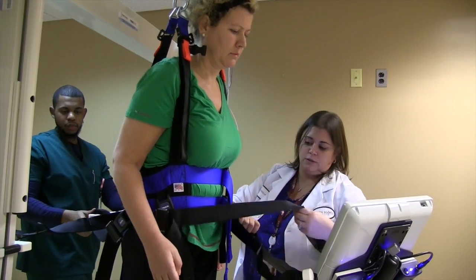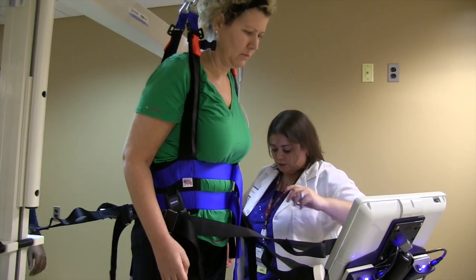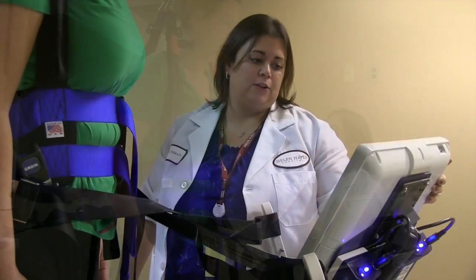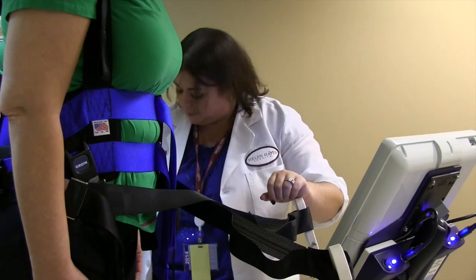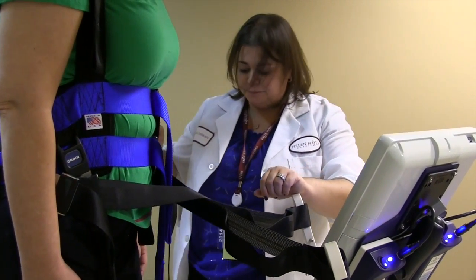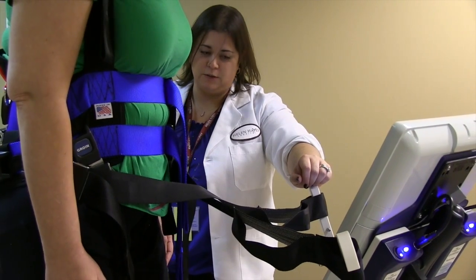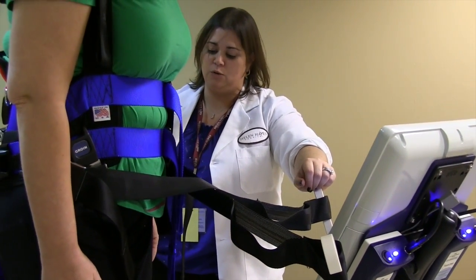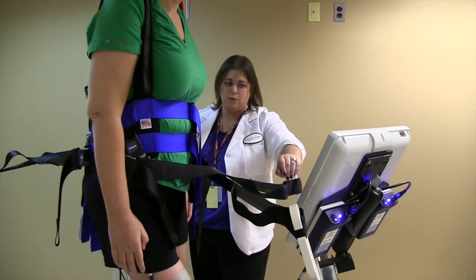You don't want the guides too tight where they hold the patient and prevent movement, but you don't want them too loose where she'd be all over the place. Right now you're not going to feel any stim, but the speed of the stepper is going to start to pick up. This is our warm-up phase, which is about two minutes — just getting your body used to being upright in the harness and having weight going through your legs.